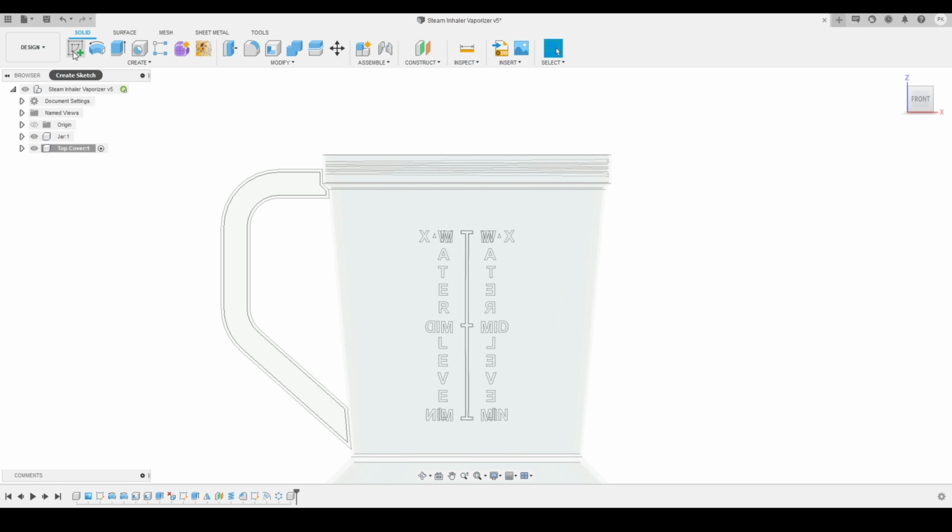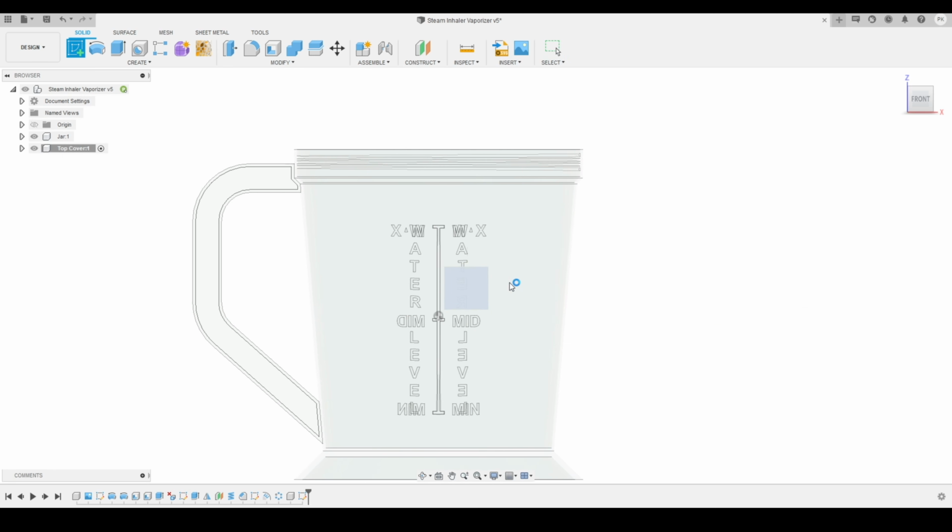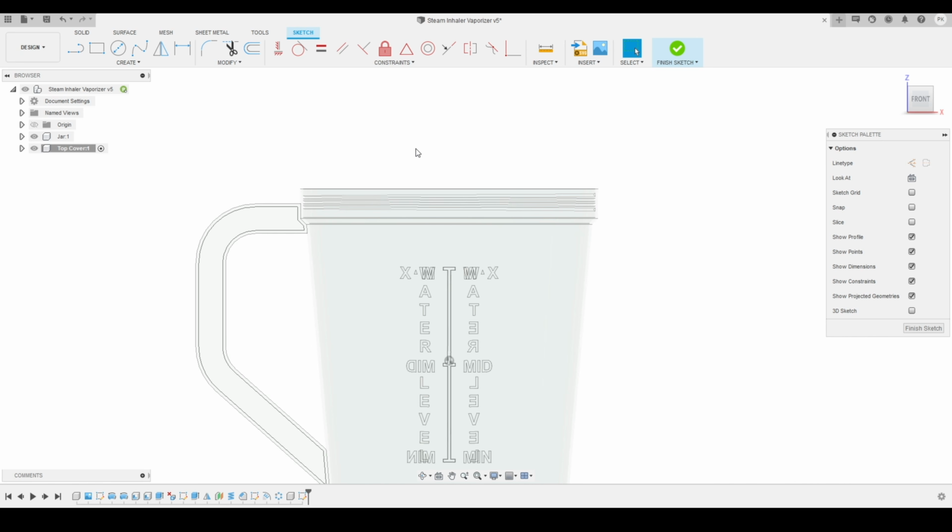I will go on to create a sketch over here, and will select the plane on which I want to create the sketch. Here you can see, and now I will start creating the sketch.